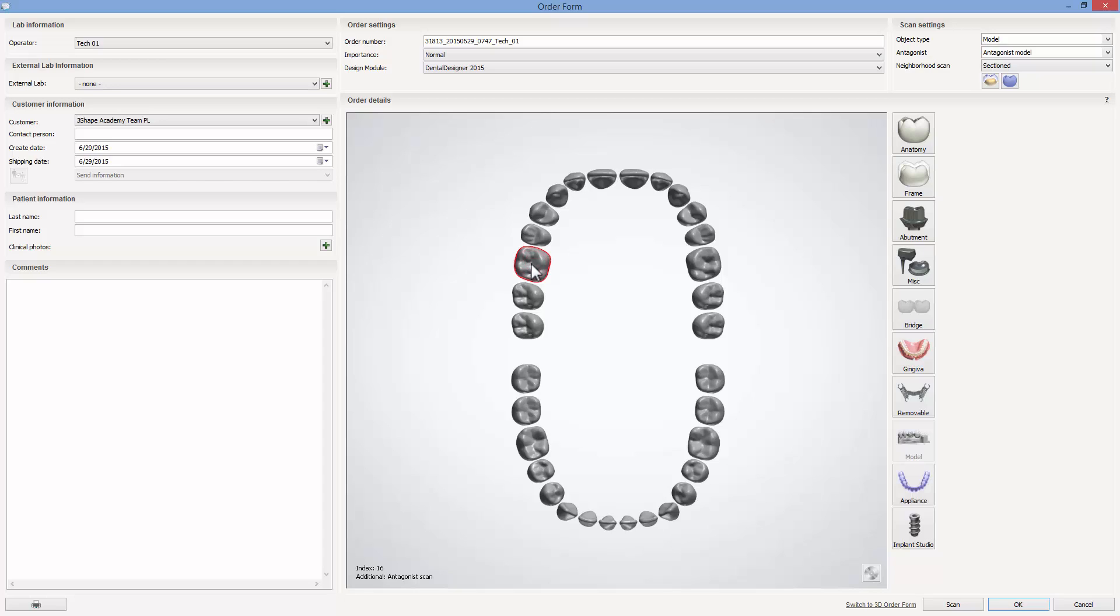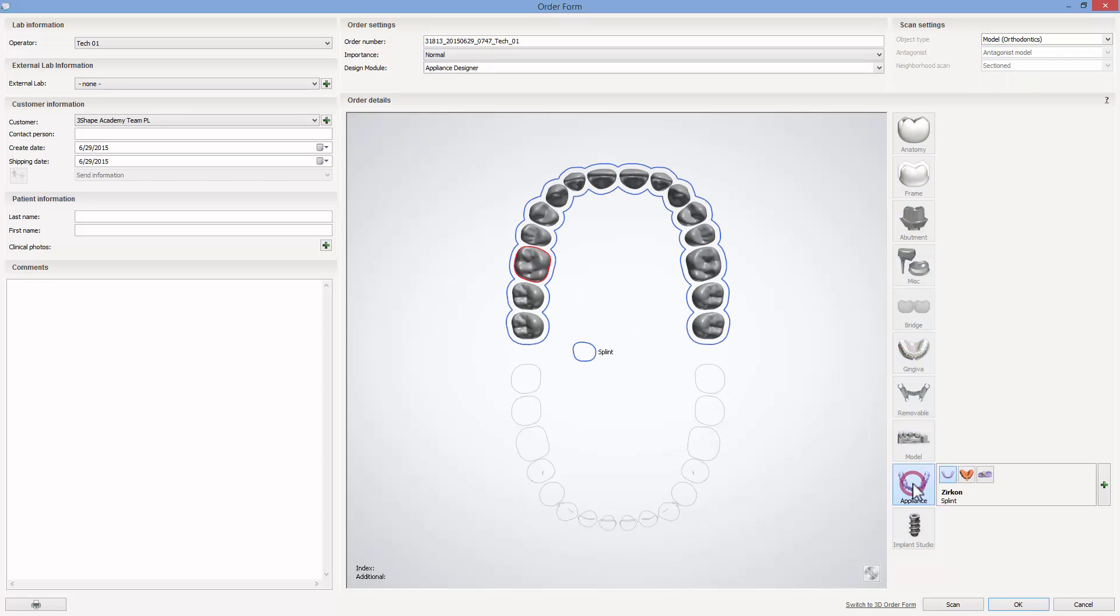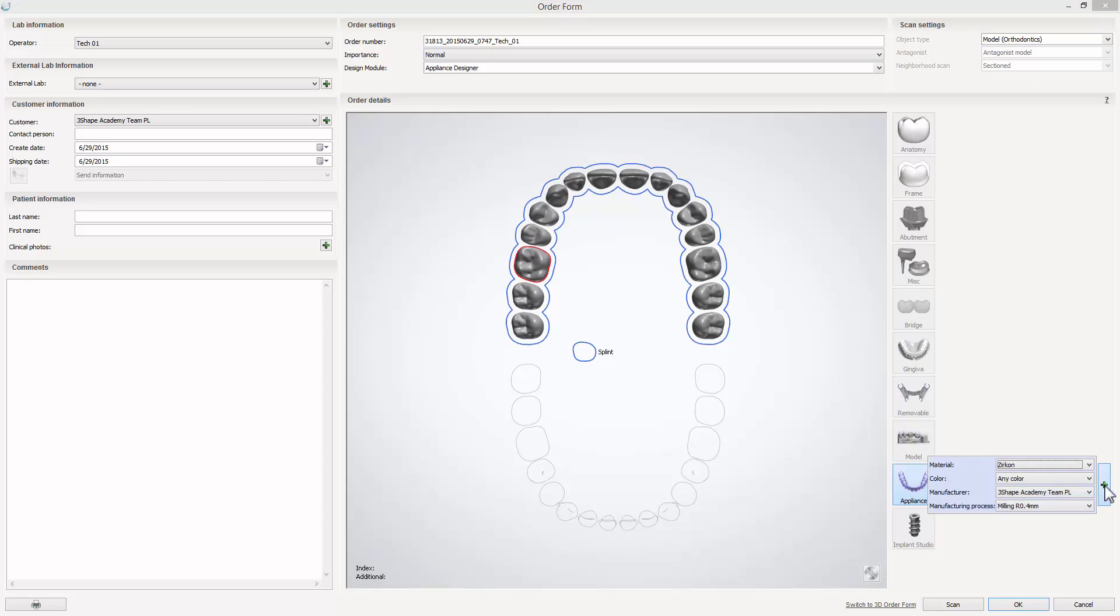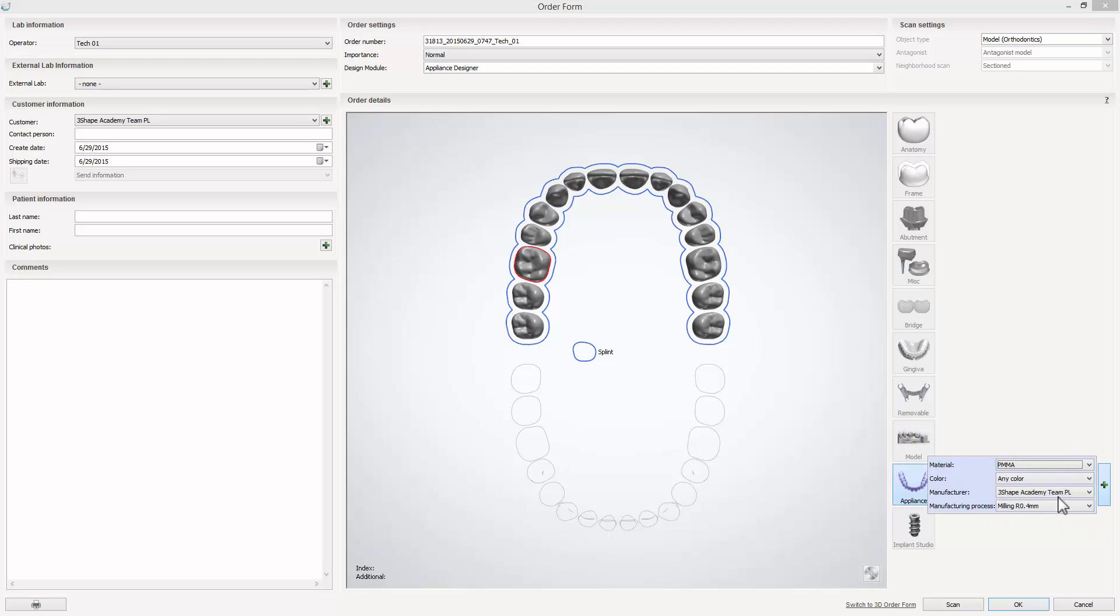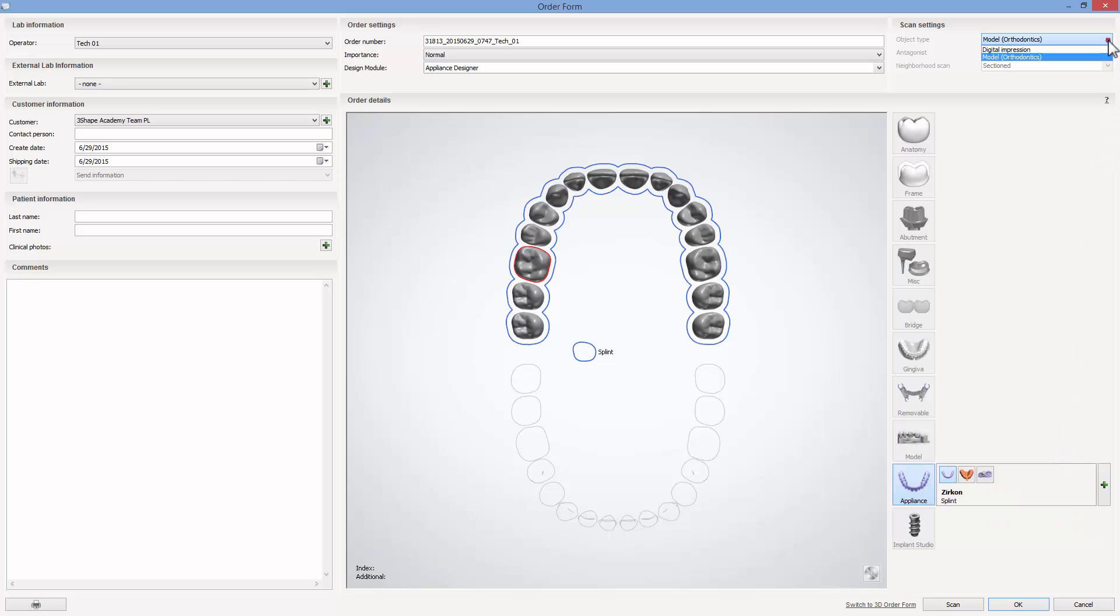To start your design, fill in the order form. While designing a splint you have an option to work either with orthodontic model or digital impression. In our case we use digital impression.